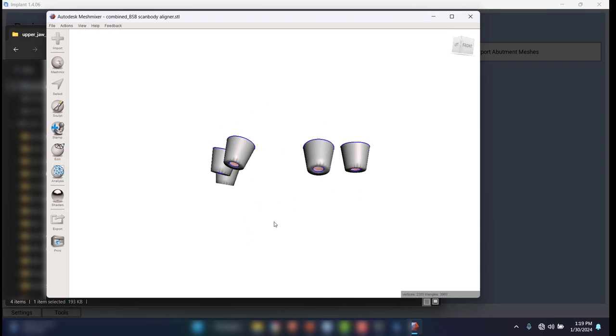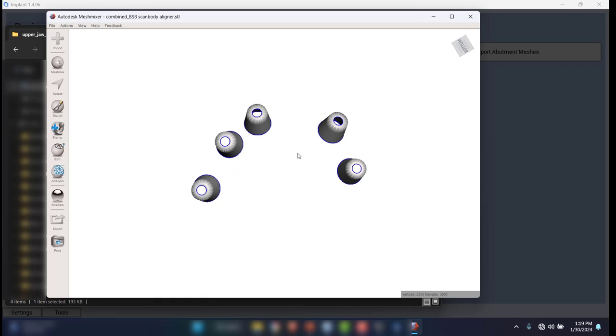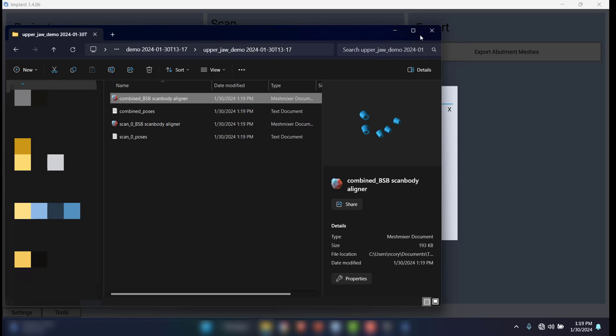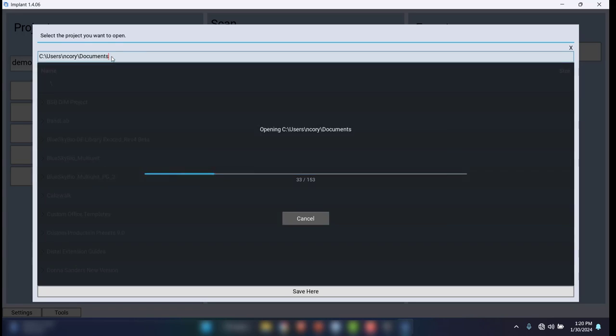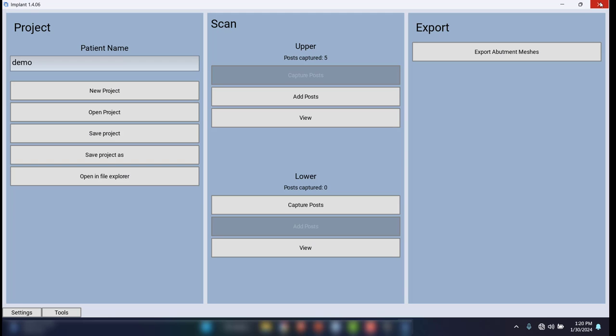Now, in and of itself, this doesn't do me a lot of good just yet. What we'll have to do at this point is go into Exocad and stitch all this data. So I'm going to close down that screen. I'm going to save the case, so I've always got that and can go back to it. Really, at this point, the scanner has done its thing. I can shut down this software.